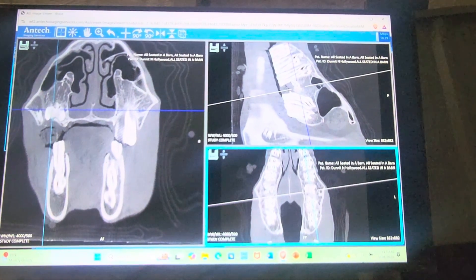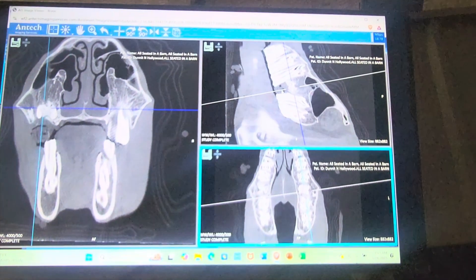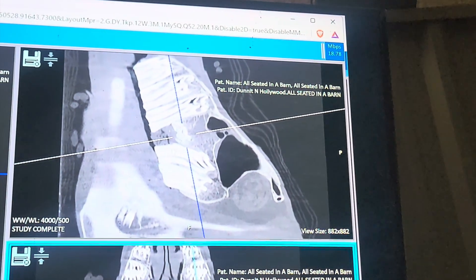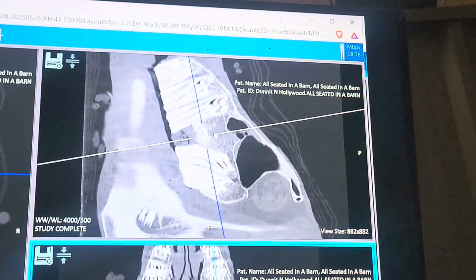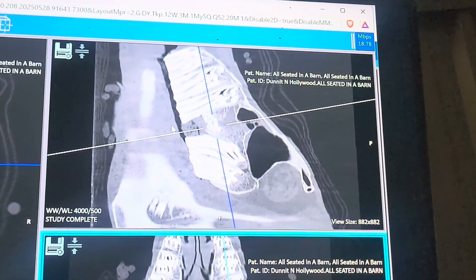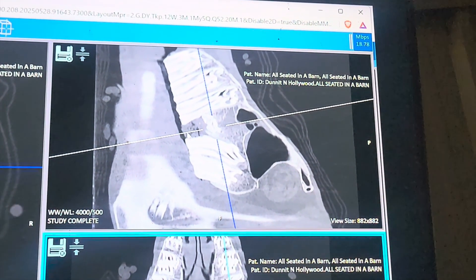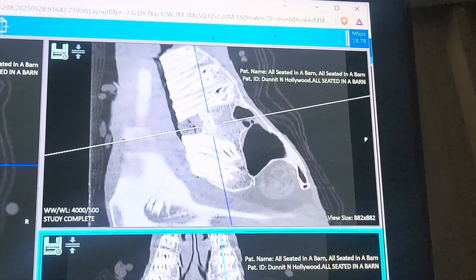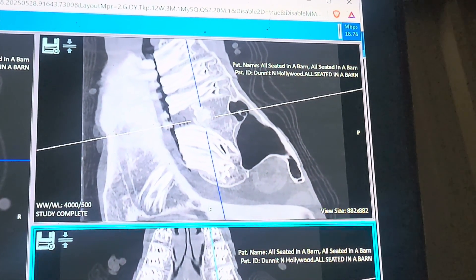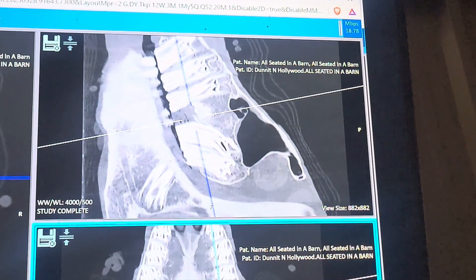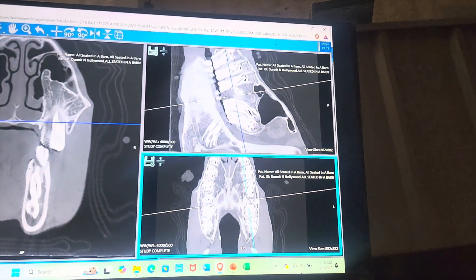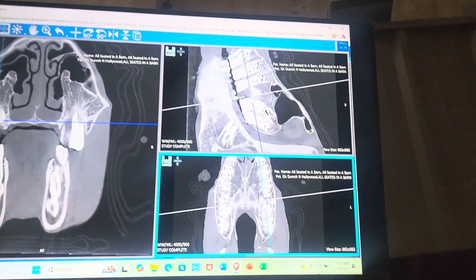The socket has some granulation tissue with draining tracks and the adjacent teeth have shifted in significantly. We have all of this tooth that we can't even visualize orally — we'll show you with the endoscope in a second — because of the granulation tissue and the fact that it's trapped. It's a difficult extraction, definitely a challenge.